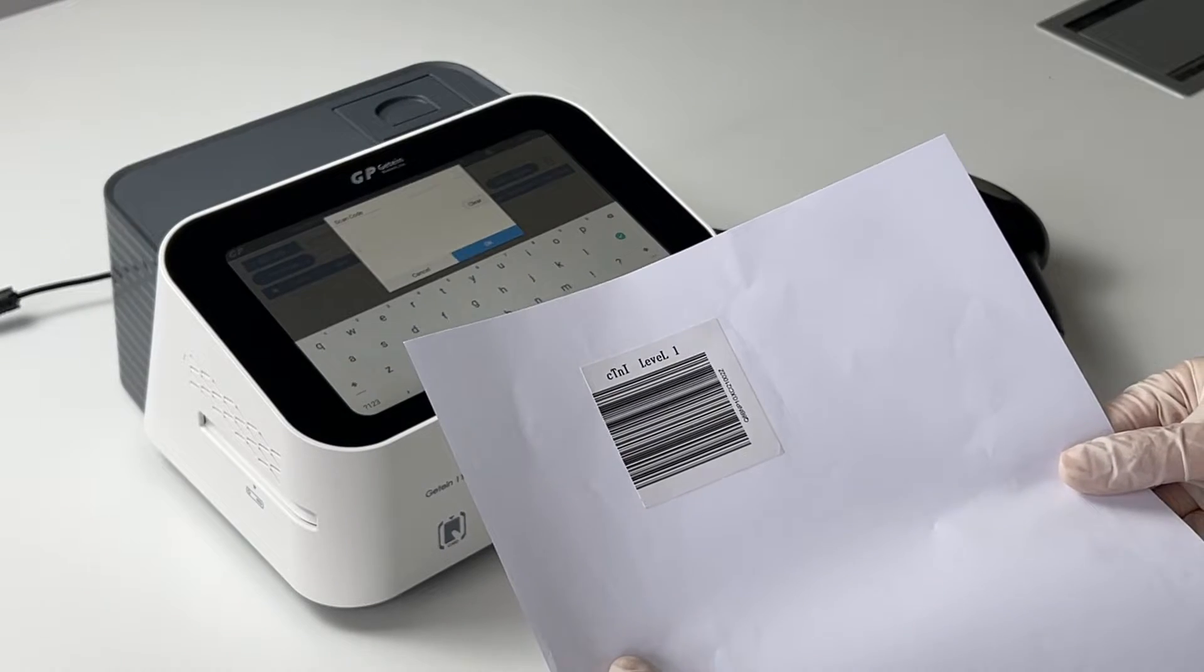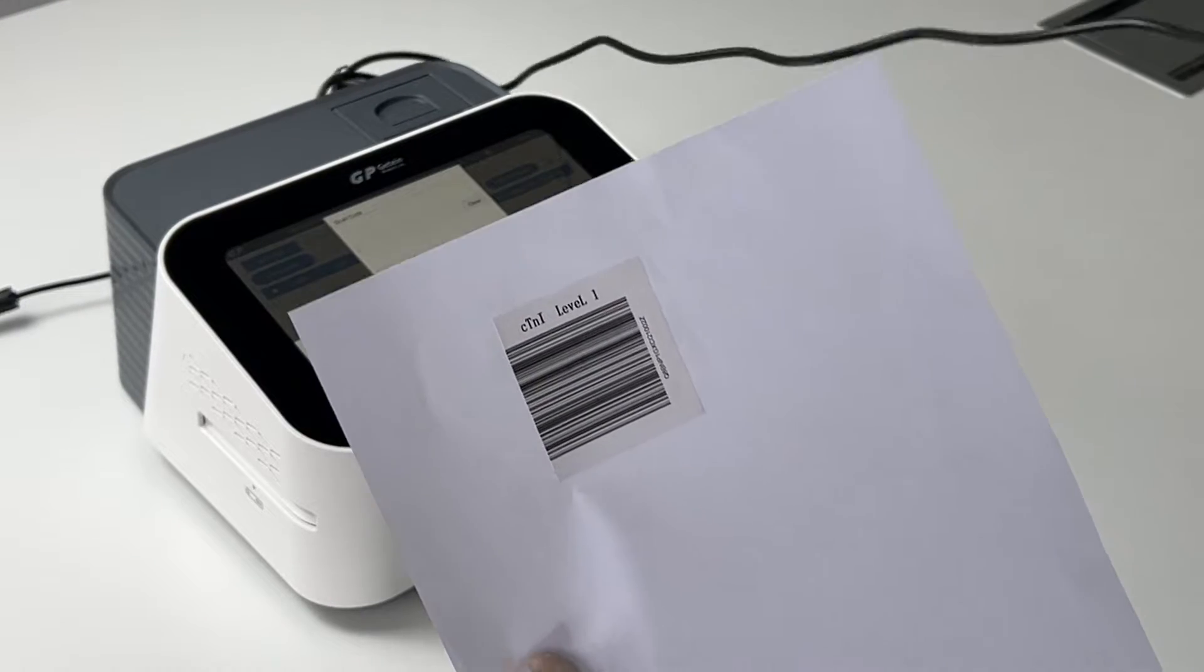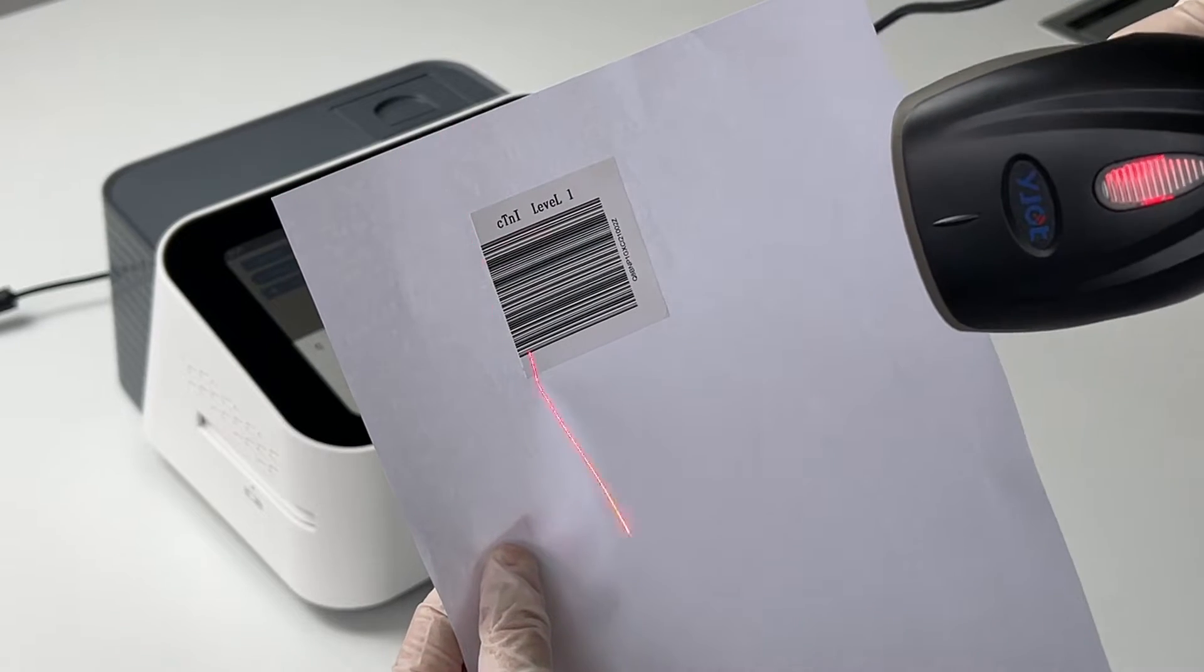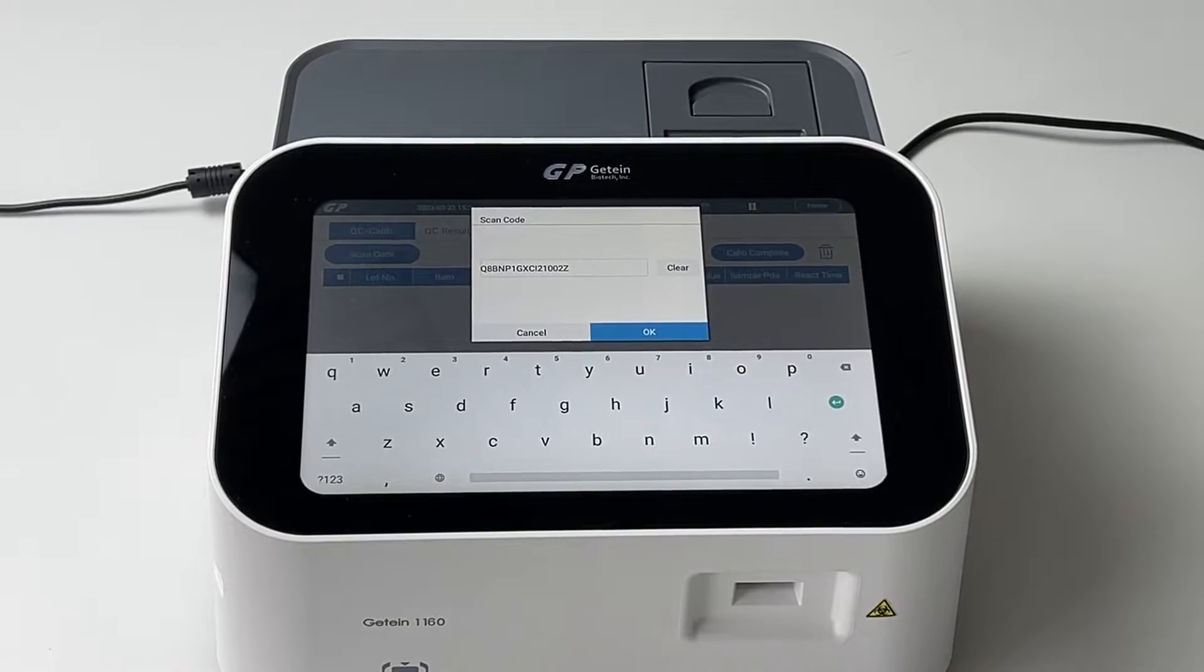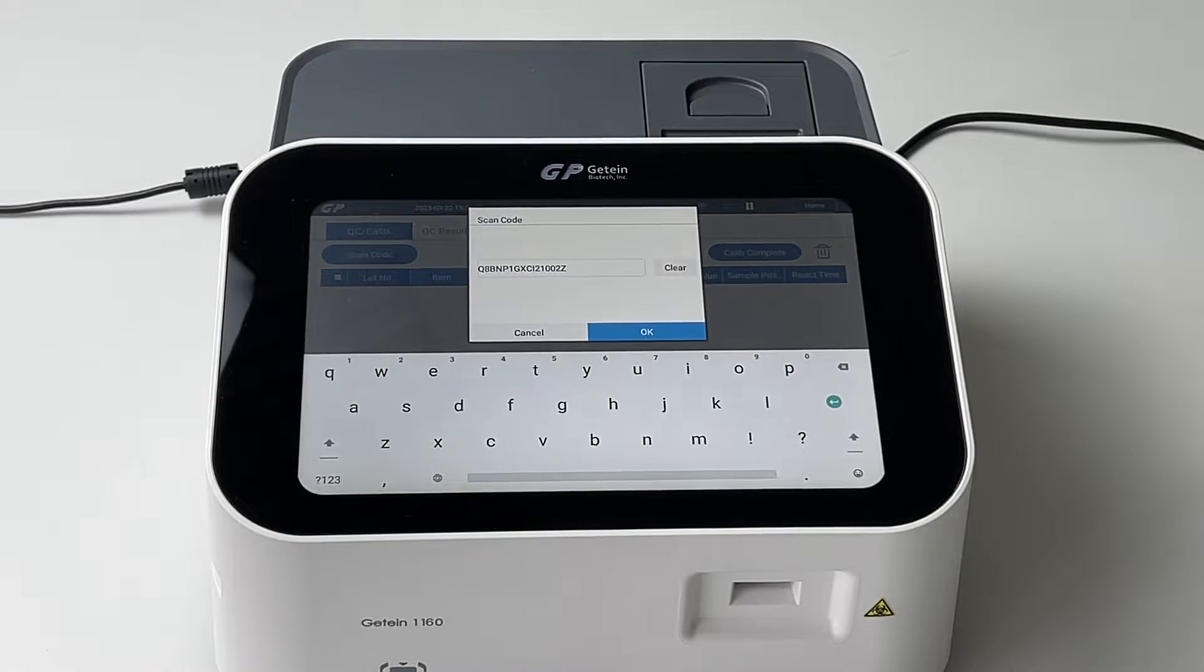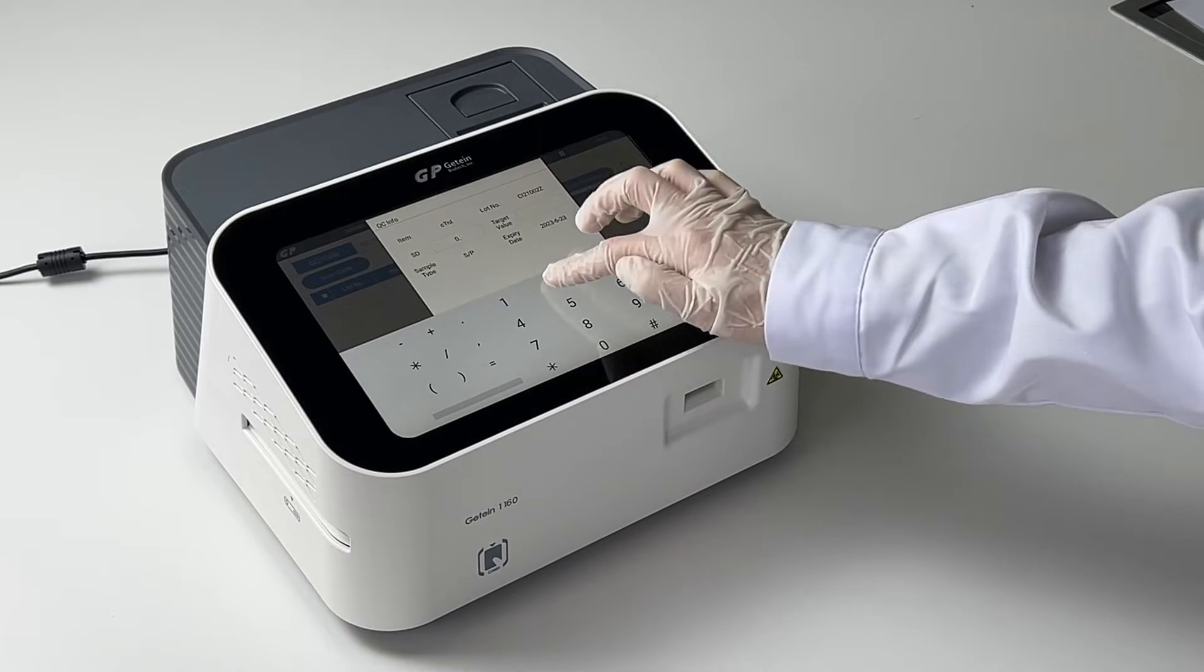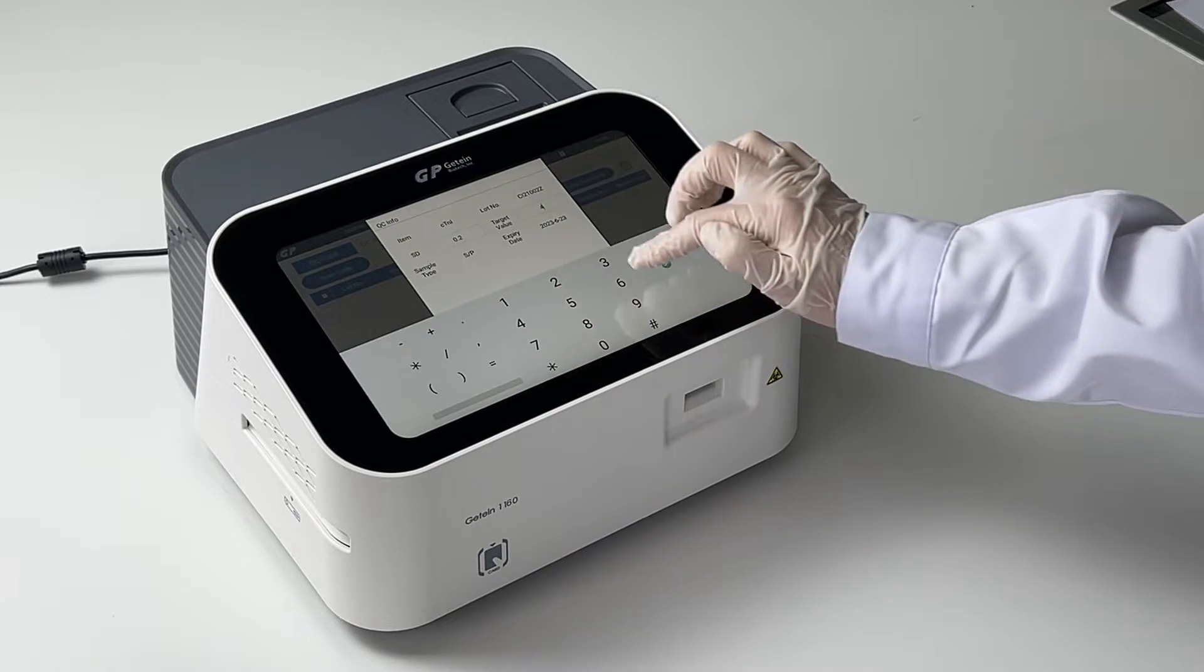Manually input the barcode number or use a barcode scanner to scan the barcode. After the Quality Control Information prompt appears, manually input the target and standard deviation values according to the target value sheet.